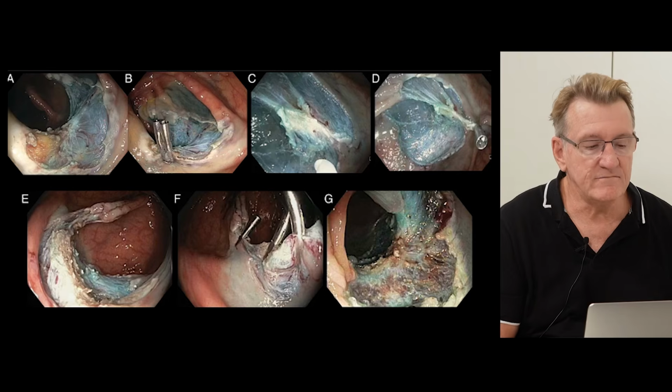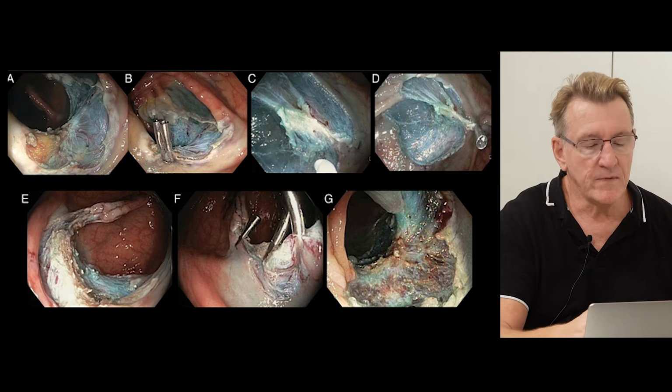You start in the non-scarred area, and when you end up in the scarred area, you get this dense submucosal fibrosis, and that is definitely a risk factor for delayed perforation, because you may have injured the muscle without knowing, because it's tacked onto the mucosa. So type 2 is linked to fibrosis, mostly. Type 2 is fibrosis, and when you see that, that is a strong indication for complete closure of the area of the type 2.